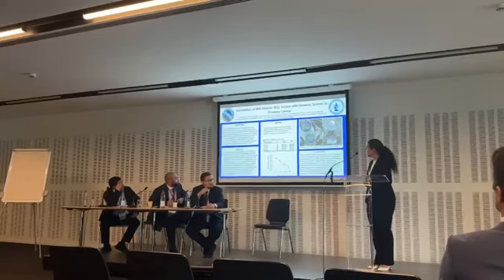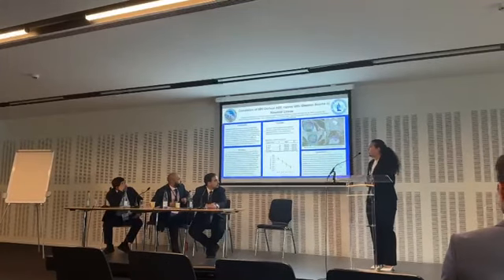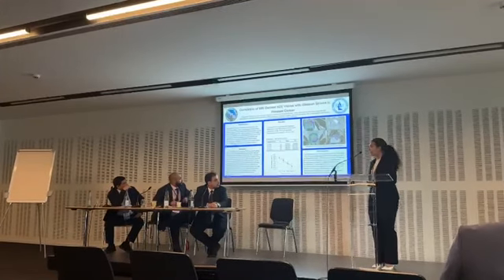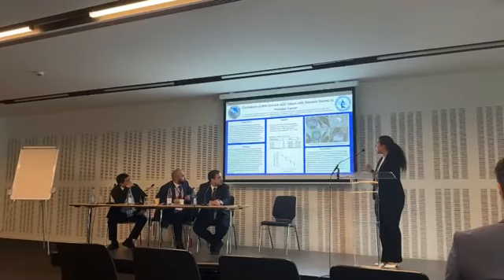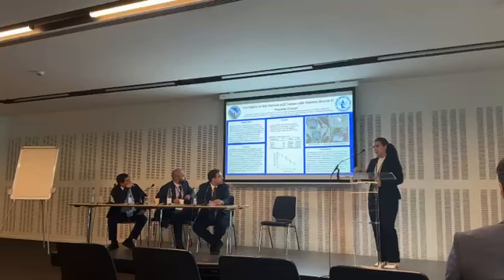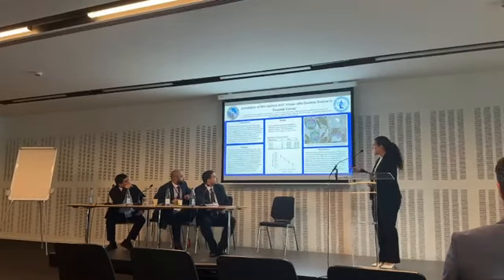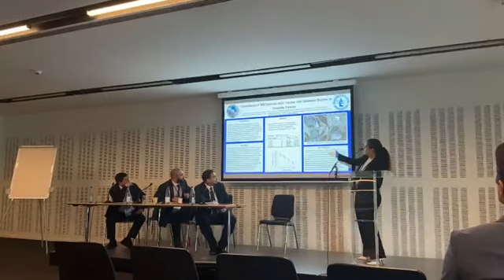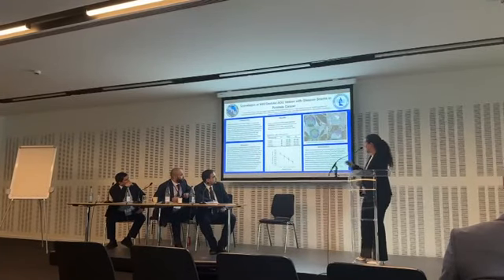So in my project, we sought to assess the relationship between the minimum MRI-derived ADC values and Gleason score in prostate cancer. In this Western IRB approved study, we assessed 181 lesions by manually tracing them on the MRI, and then finding the minimum ADC value and correlating it with its Gleason score. As you can see here, there was a stepwise decrease in the ADC values as Gleason score increased.